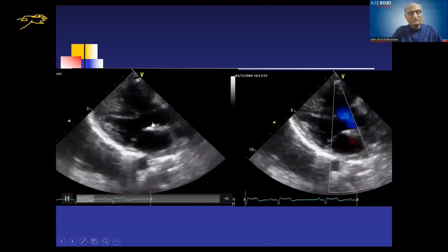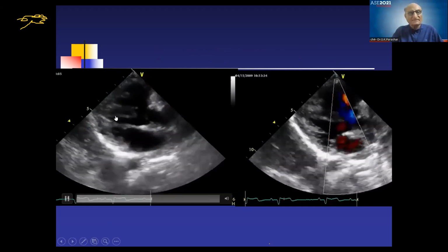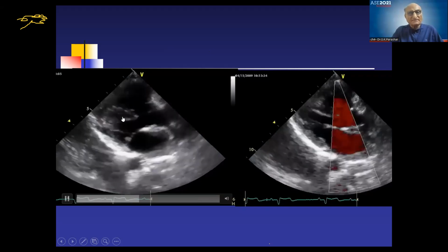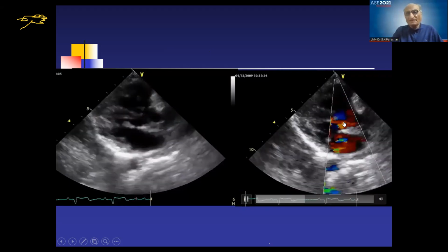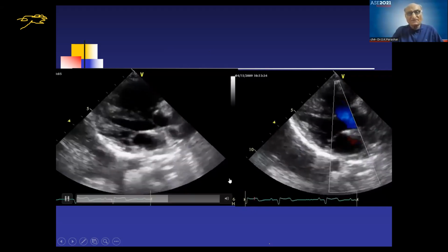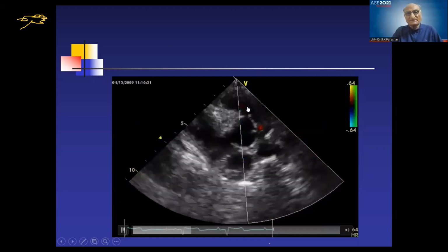Now, in this case, you see this is the aortic override. We saw the RVH in the moving picture, there is an aortic override, a large malaligned VSD, and you see there is a bidirectional shunt, LV to RV and RV to LV, the blue flow. So it is a Fallot with a bidirectional shunt, and you see the turbulence starts in the subinfundibular area.